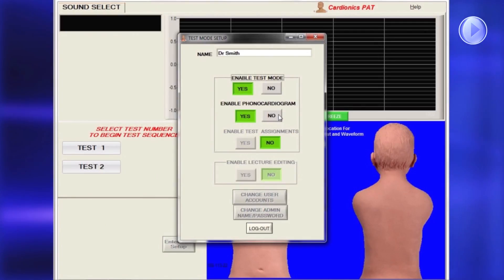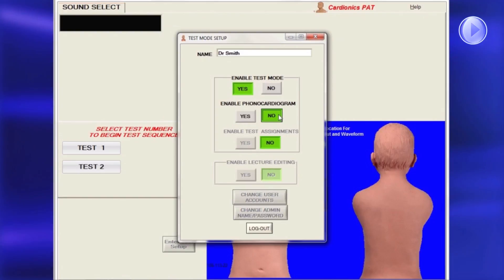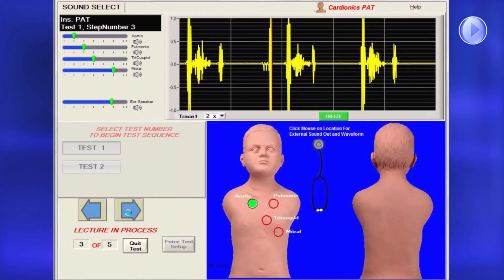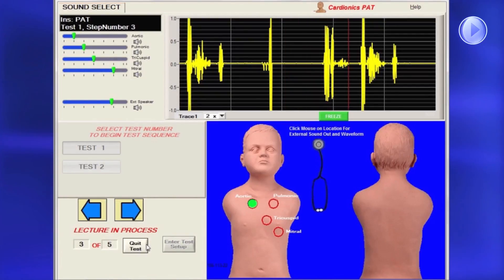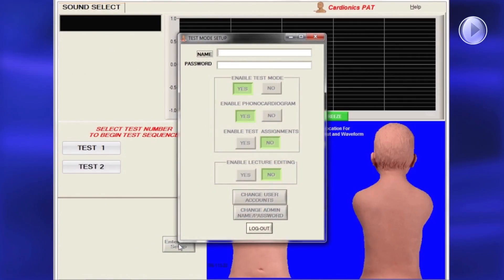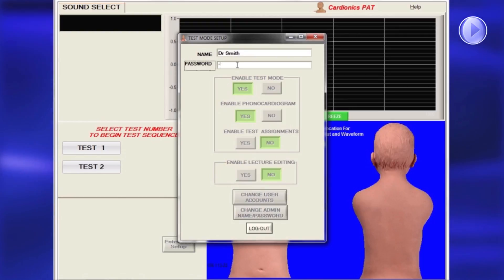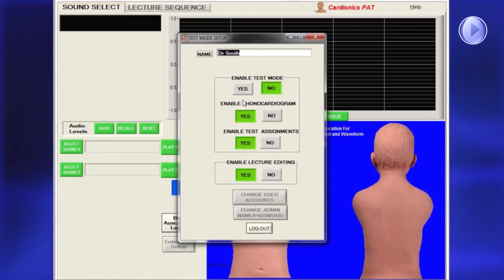Next, choose whether to display a phonocardiogram on the test. To quit the test at any time, click Quit Test. When finished, you will still be in Test Mode, so you must return to the Test Setup page and enter your name to log out.